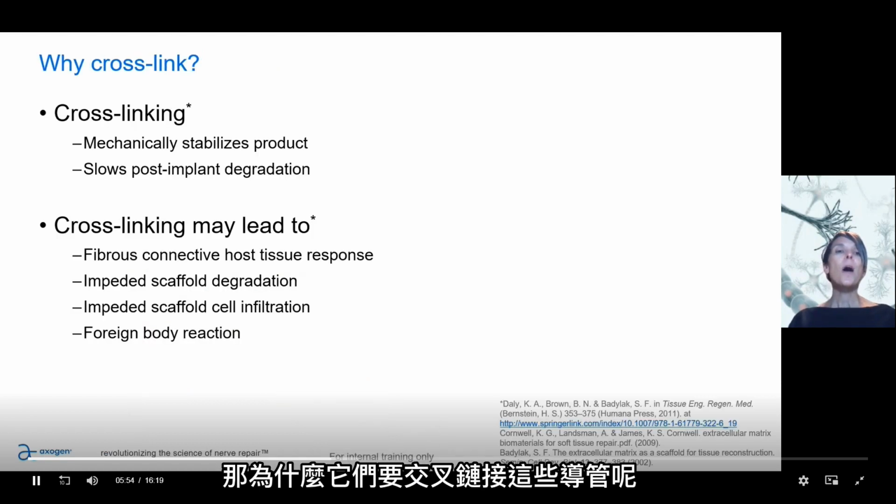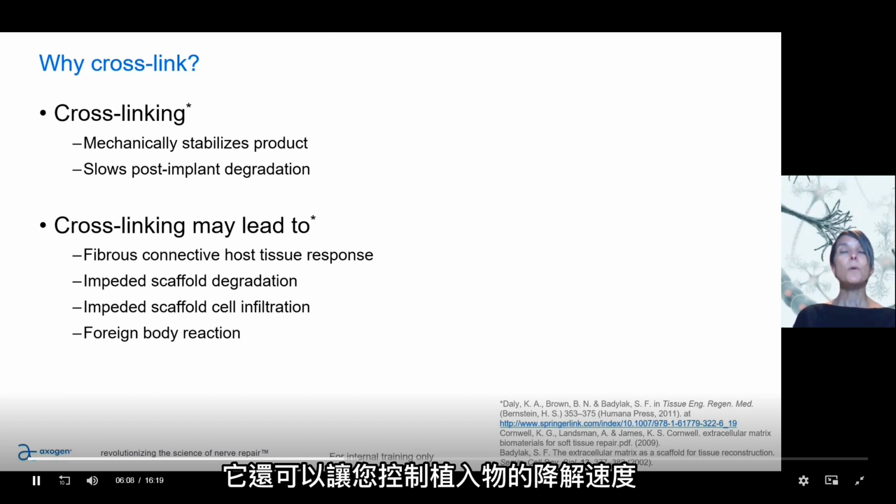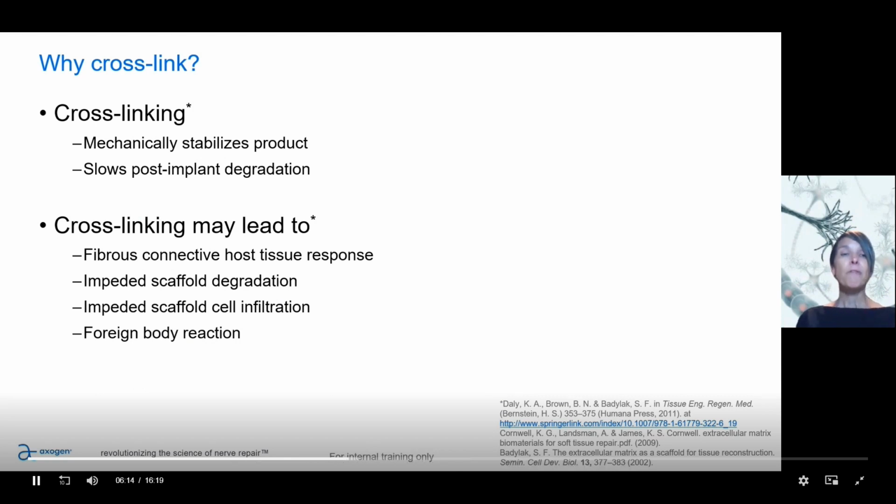And so why would they cross-link these conduits? Well, cross-linking does have some benefits. So it provides a really mechanically stable product. And it also allows you to control the degradation rate of your implant. However, it does have some downsides.